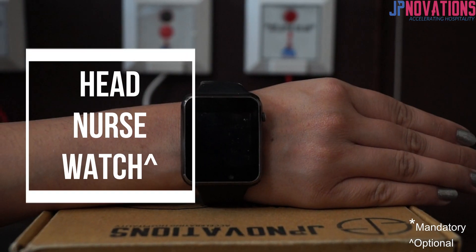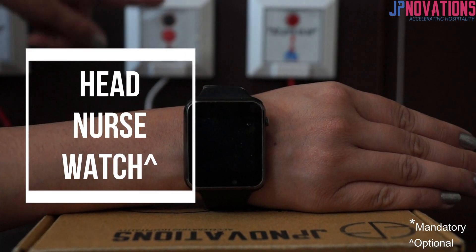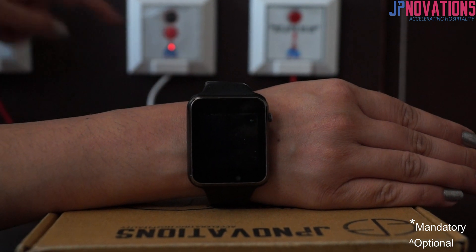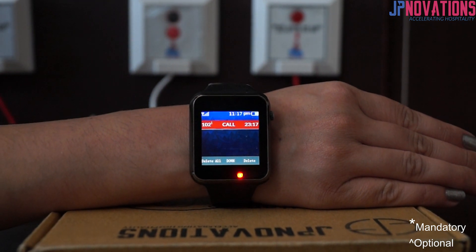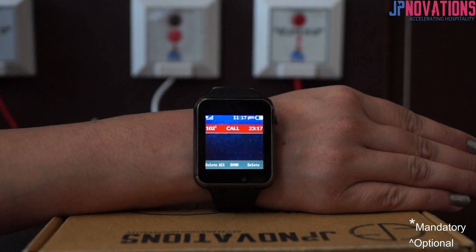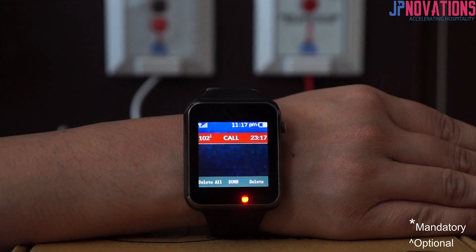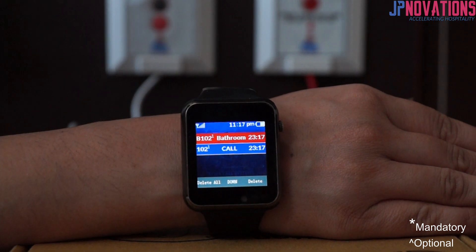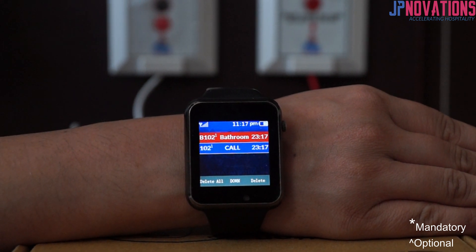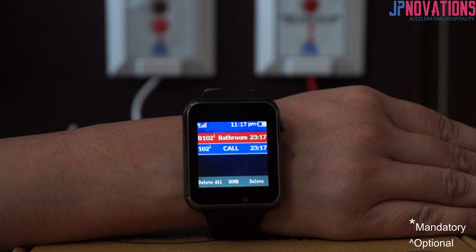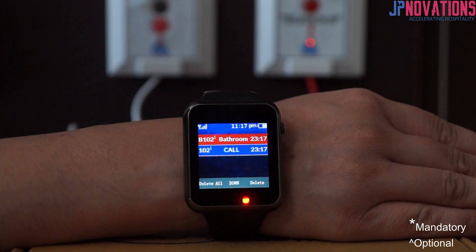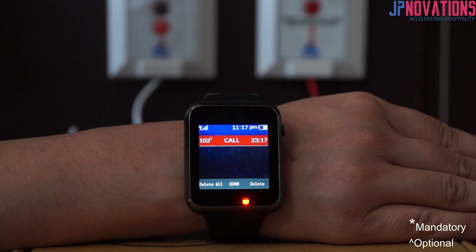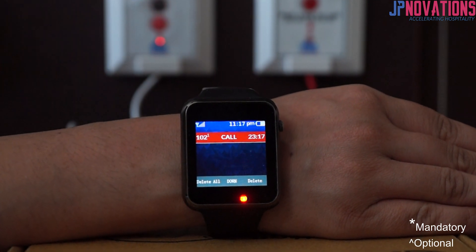Sever watch is an optional component in the system. In general it's given to head nurse for keeping an eye on the ongoing calls. Watch vibrates and beeps on receiving a new call. Also watch has a notification indicator to indicate pending calls. It displays all the ongoing calls, and on attending the calls by the staff the call is removed from the watch so head nurse can know there is no pending calls.